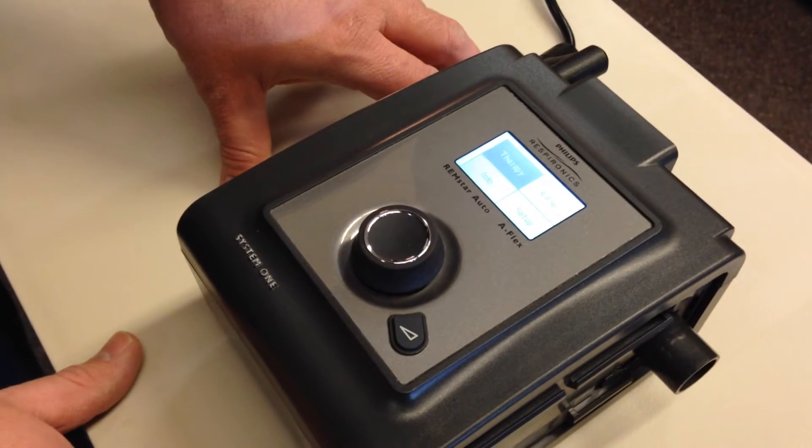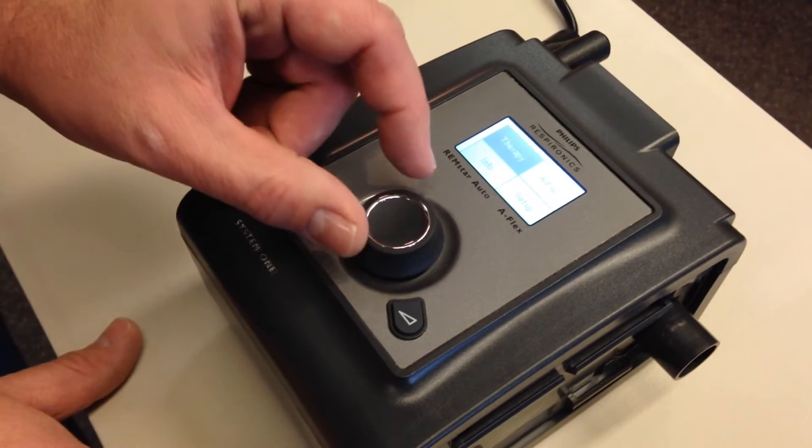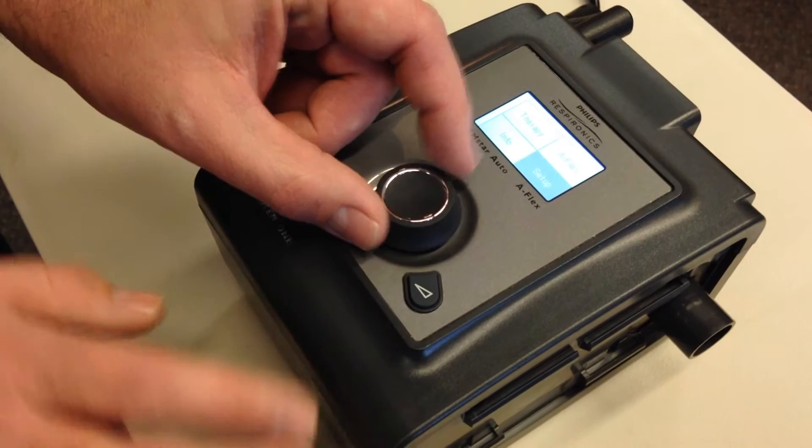To check the total hours on the Respironics System 1 device, from the home screen, select the setup option.